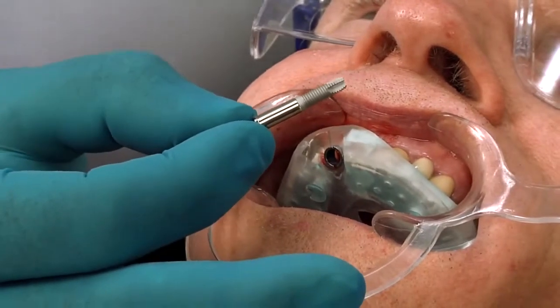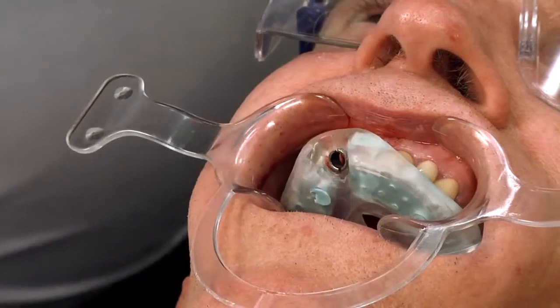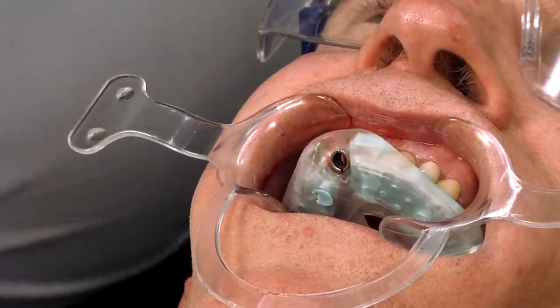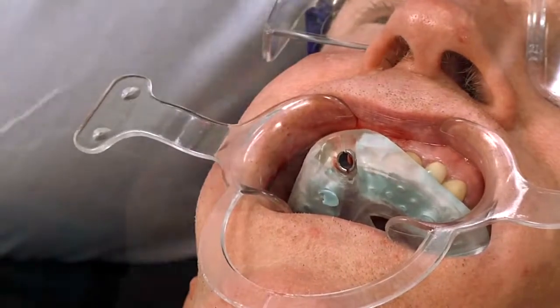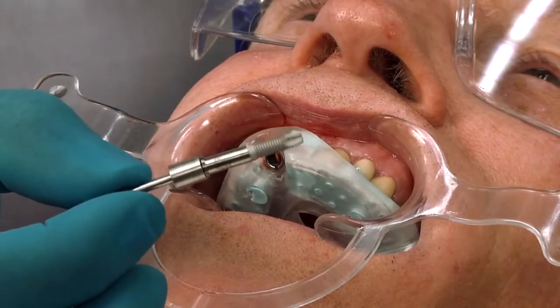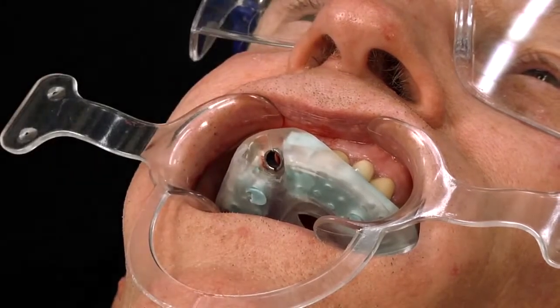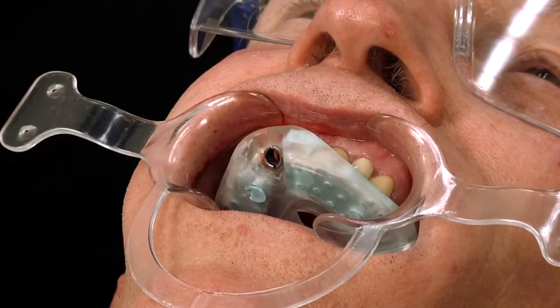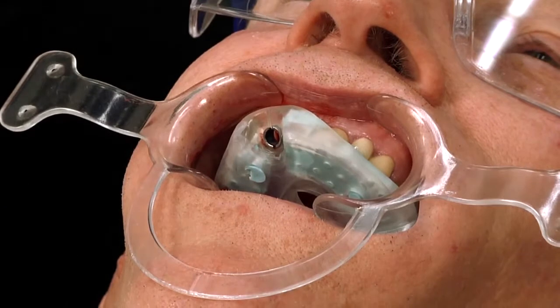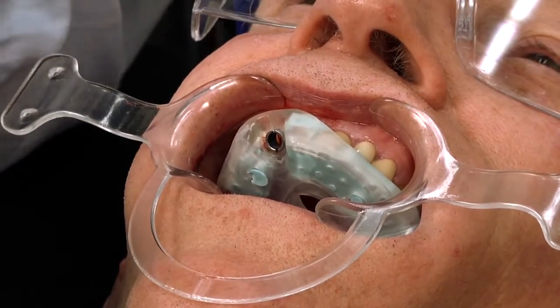So now the implant is attached to the mount, which will go through the guide. And then we have a special handle that will attach to the mount so it can go into the handpiece, just like so. And that will go all the way down through the mast cylinder. I'll place it onto my handpiece.